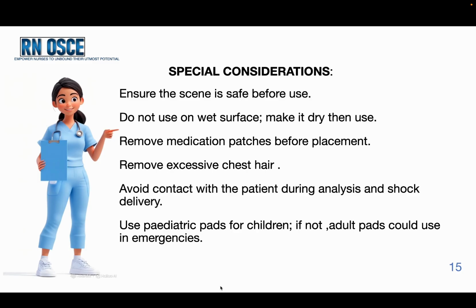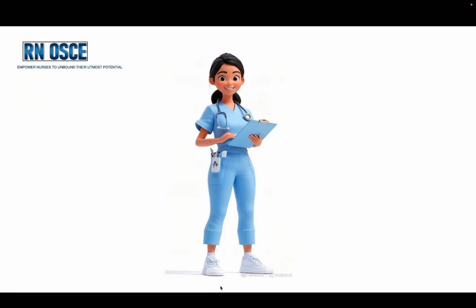Do not touch the patient during rhythm analysis or while delivering the shock. And always keep in mind, use pediatric pads for children whenever available. If unavailable, adult pads may be used in certain emergencies.